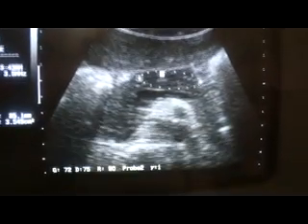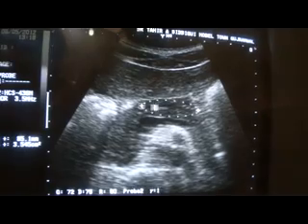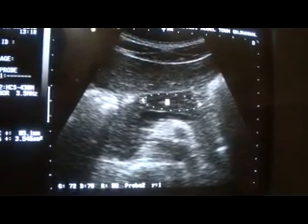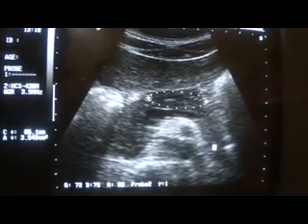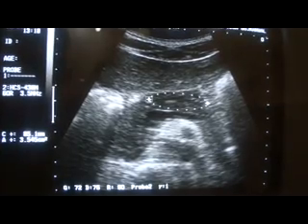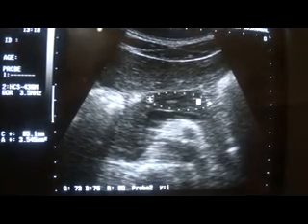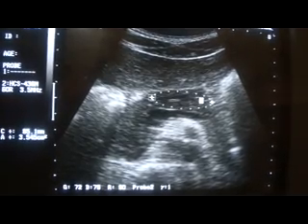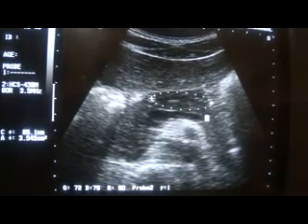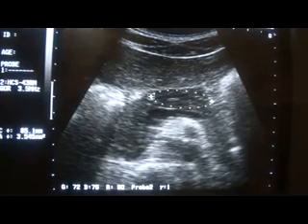Now see that again. I'll press the probe in the mid-epigastric region, just below the xiphoid process, and may have to come a bit downwards or a bit upwards depending upon the patient.